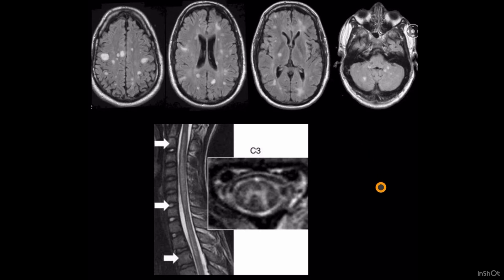What happens in ADEM — first, see the spinal cord. On T2, you can appreciate there are hyperintense signals that are expanding. The characteristic finding you see on axial section: you can appreciate the lesion is focusing centrally, at the center of the spinal cord.